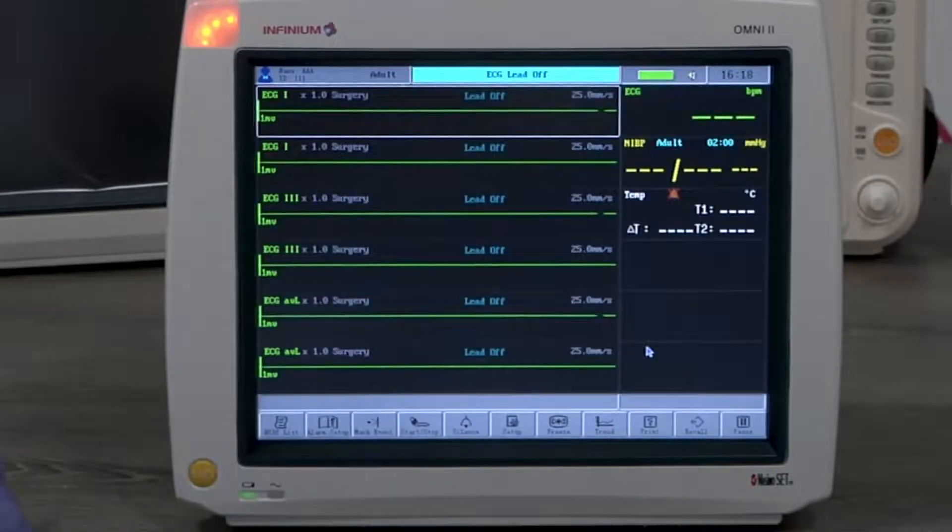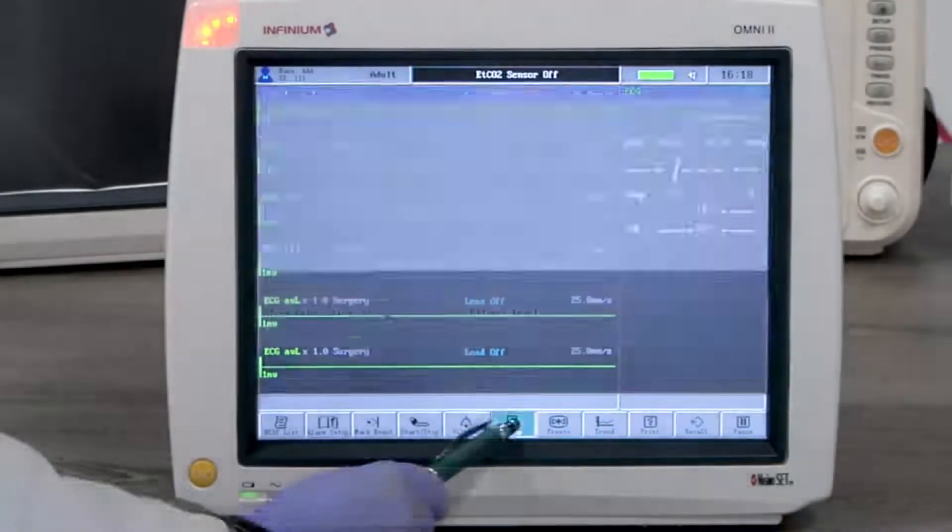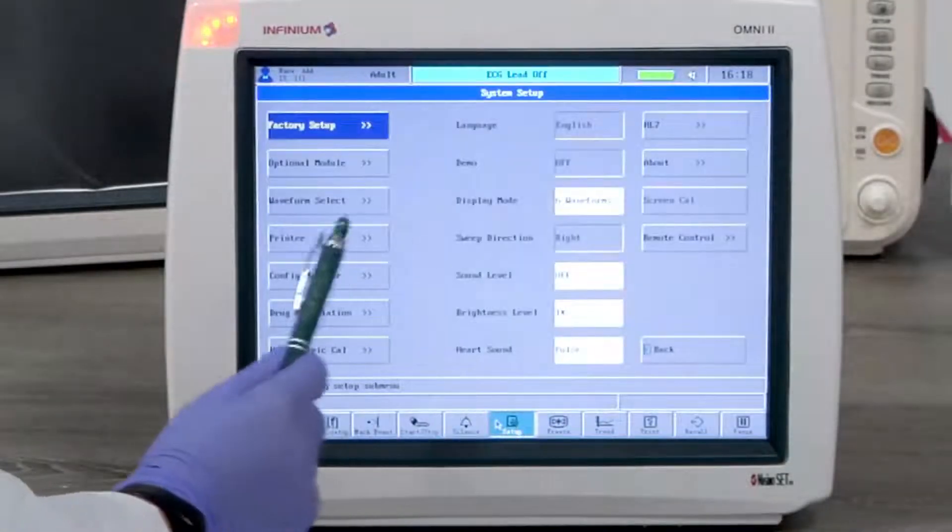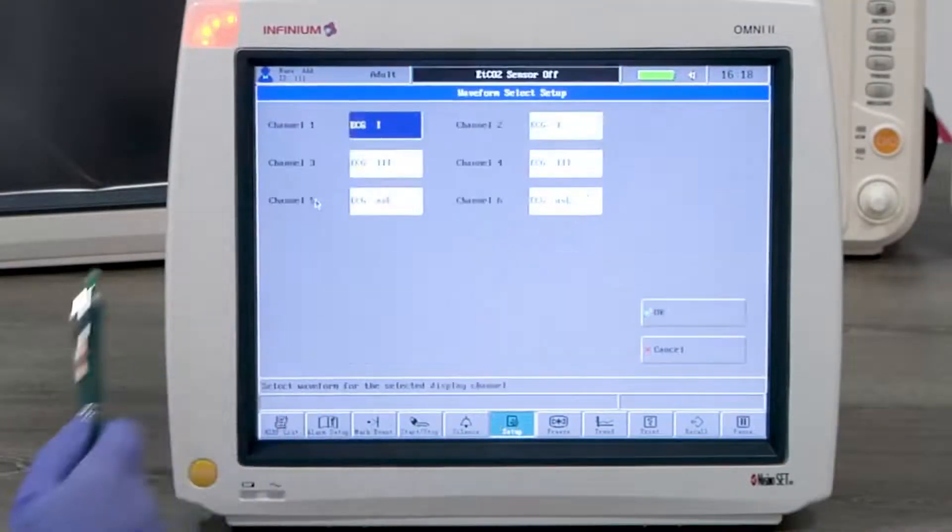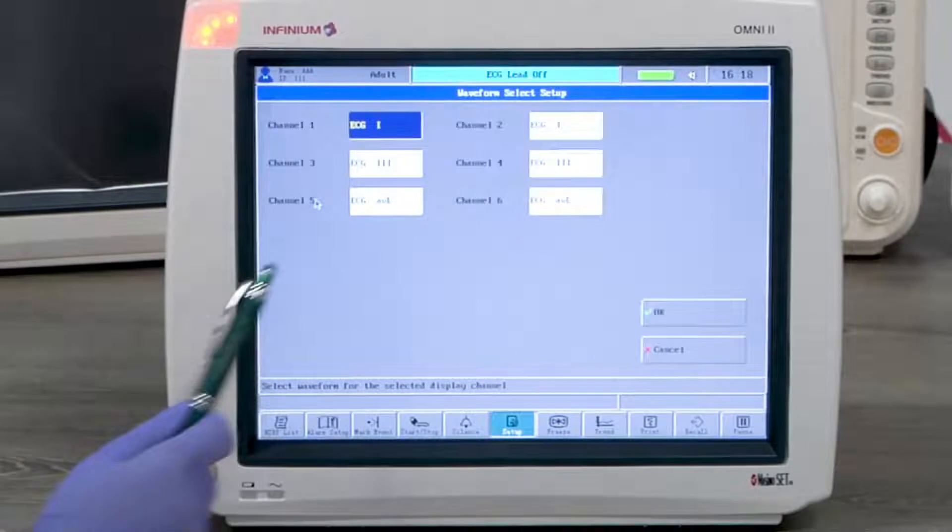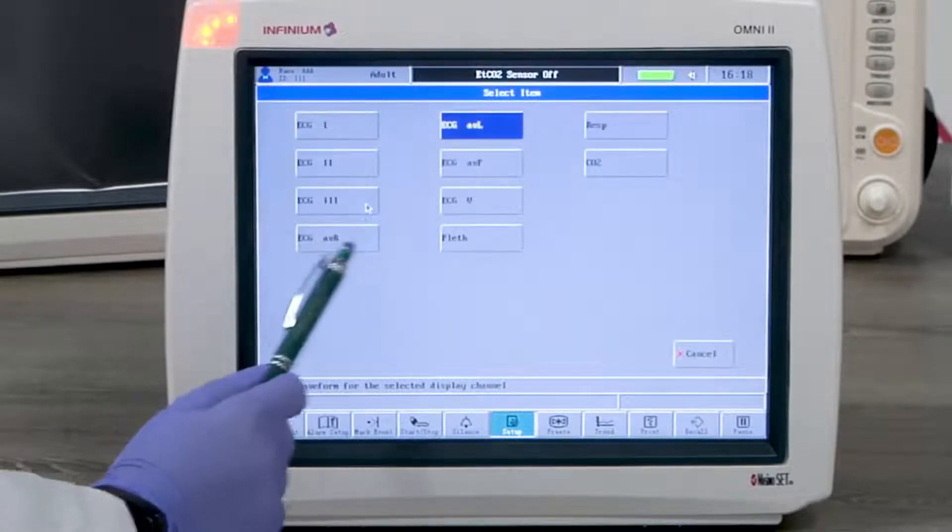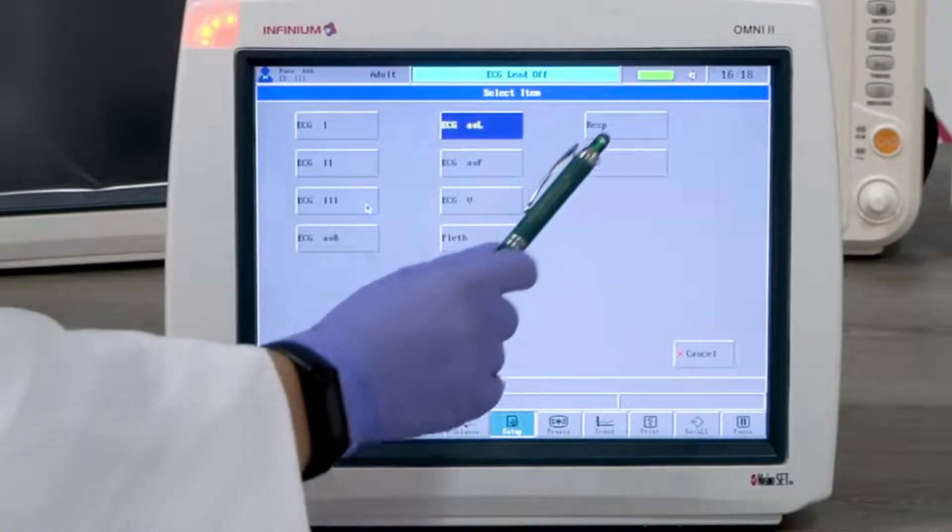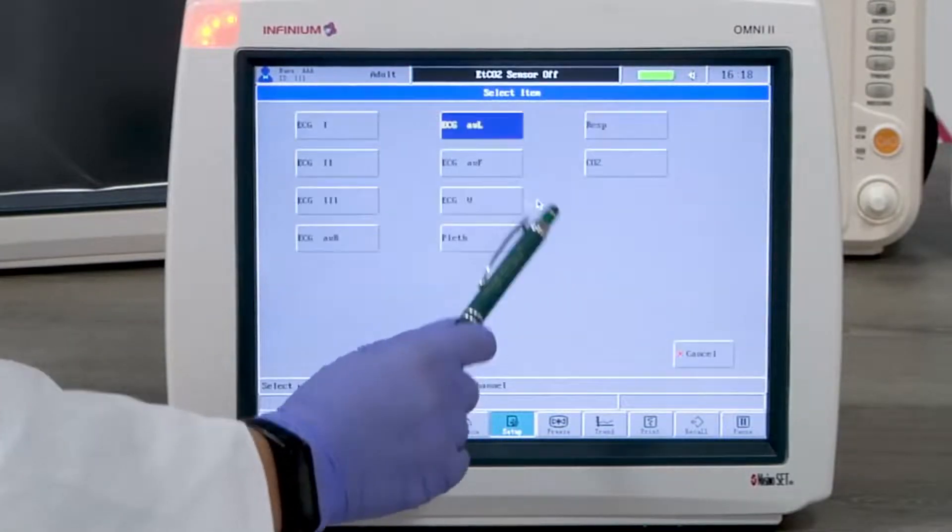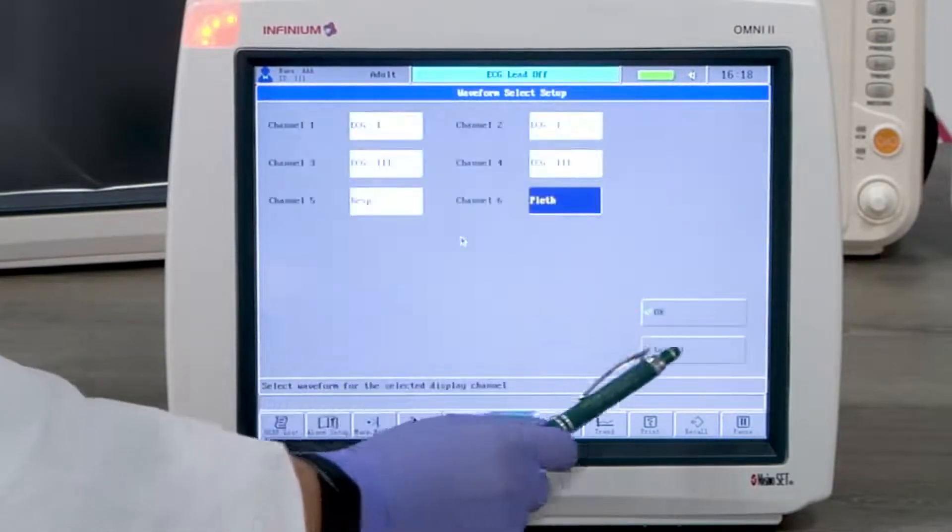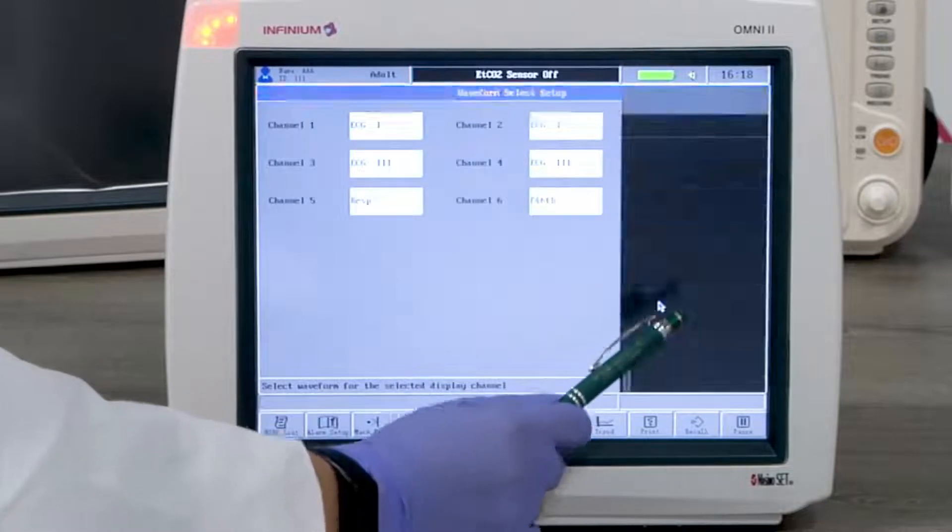Go to setup menu and click waveform select. Now select the last two channels to display respiration and SPO2.